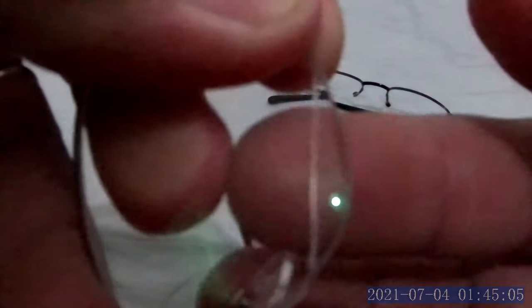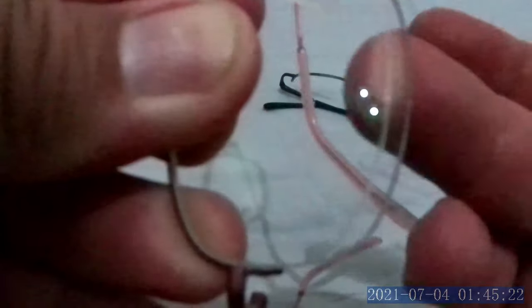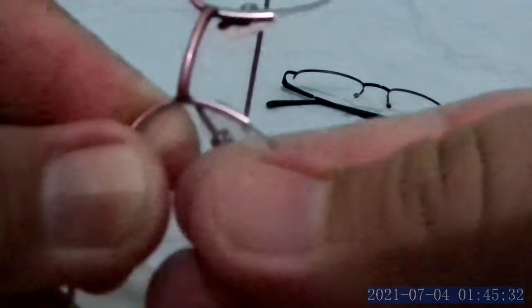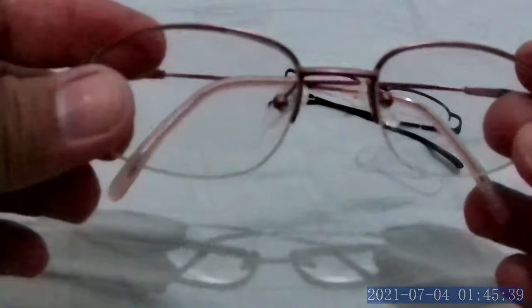Just slide the string down to be able to insert the nylon into the lens groove. Slide it down like that — you'll hear a snap, which means it's held. Do the same on the other side: nasal part first, then the temple arm. Slide the string and you'll hear the snap — that means it's already inserted.